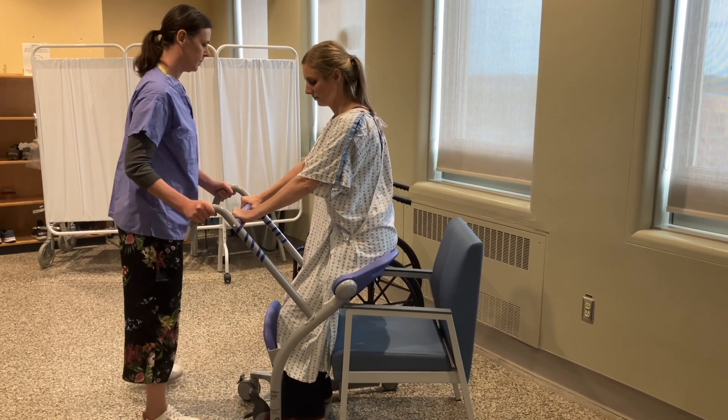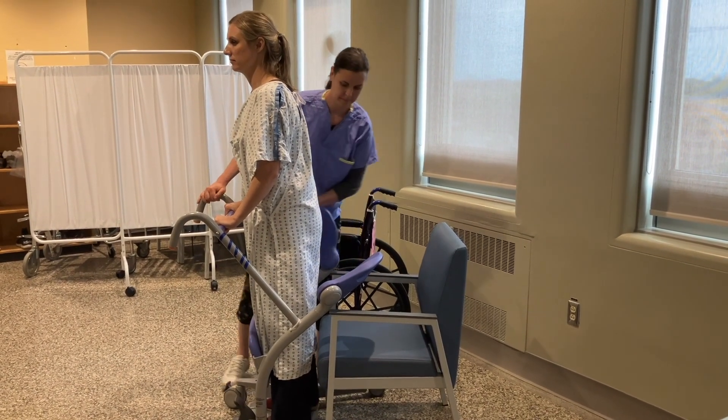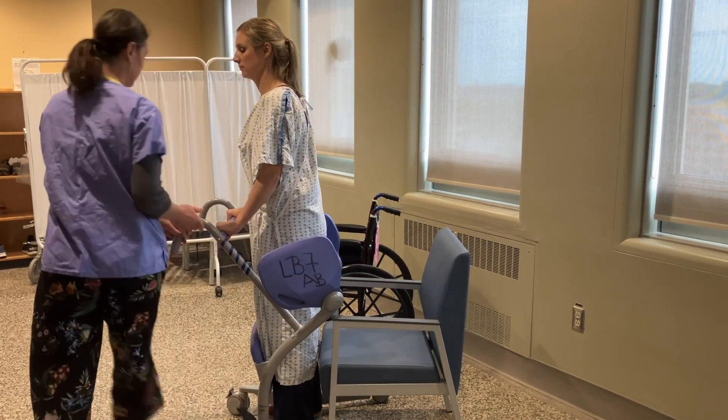When the patient's in the right position, put the brakes on the Sarah Steady and ask your patient to stand. Swivel the paddles out of the way so the patient can sit.